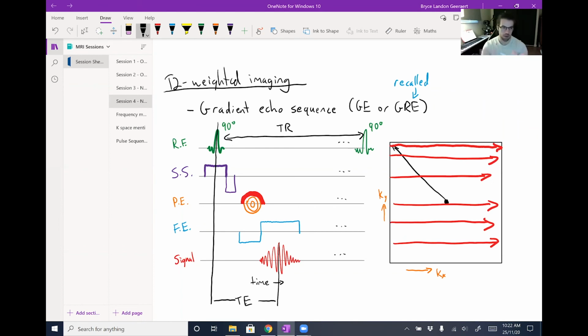I'm only going to talk about two-dimensional k-space in these sessions, really, but it's possible and quite common actually on MRI scanners to acquire a three-dimensional k-space and then reconstruct the whole volume at once. So in the case of the brain, you would be recording information in the KX, KY, and KZ direction. And when you did the inverse Fourier transform, you wouldn't get a slice of the brain, you would get the whole volume of the image you're acquiring, which in this case would be the brain.